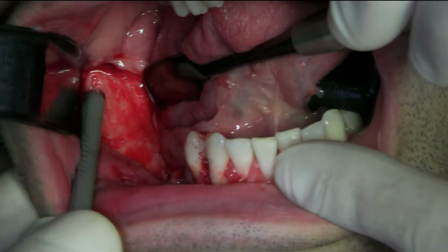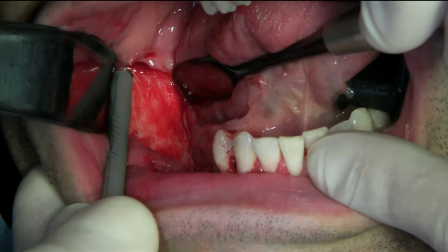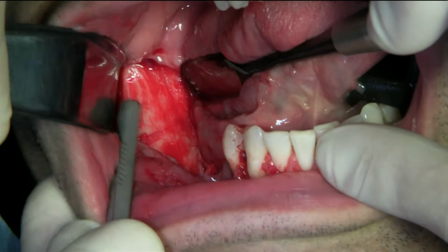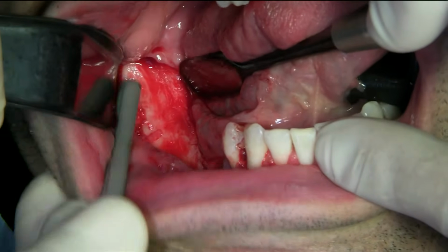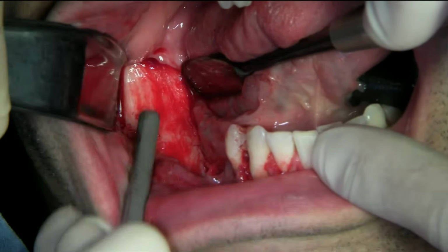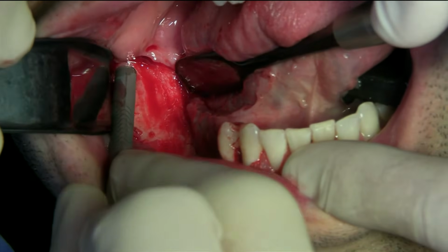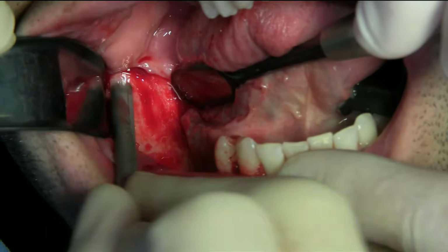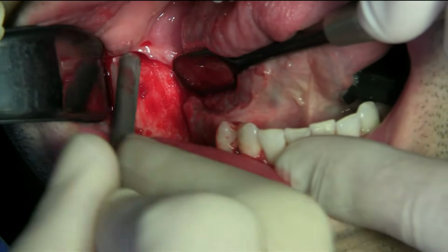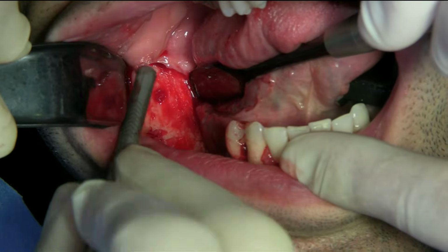This is posterior to the area where we're going to graft. You're good there on visual.